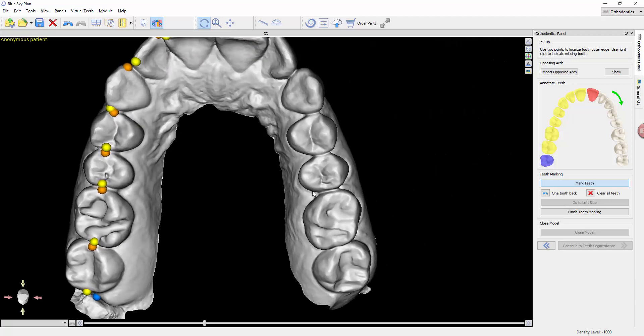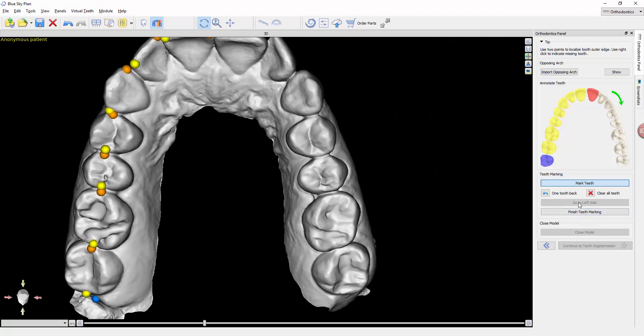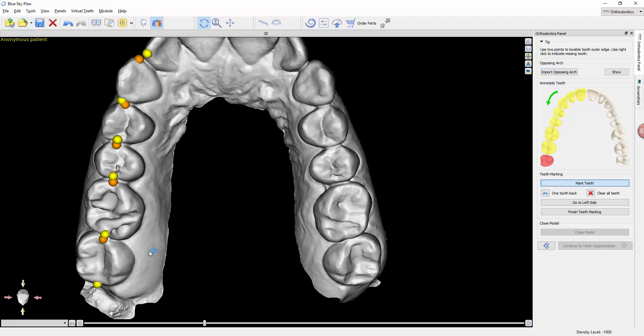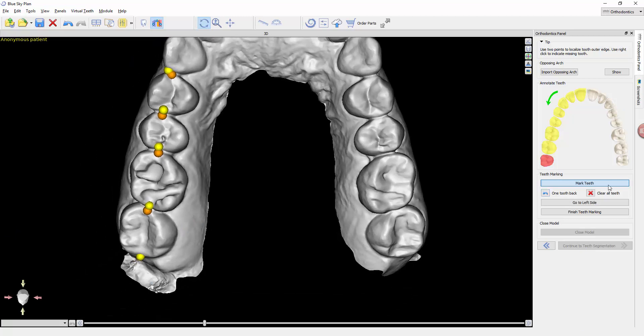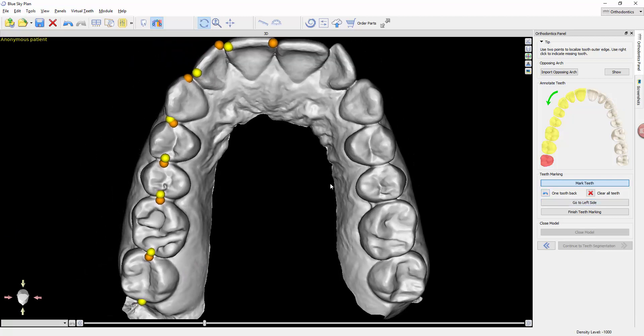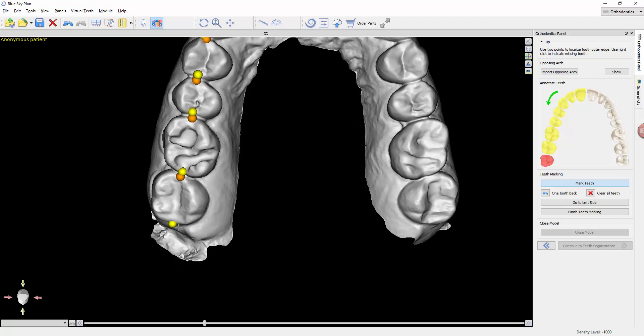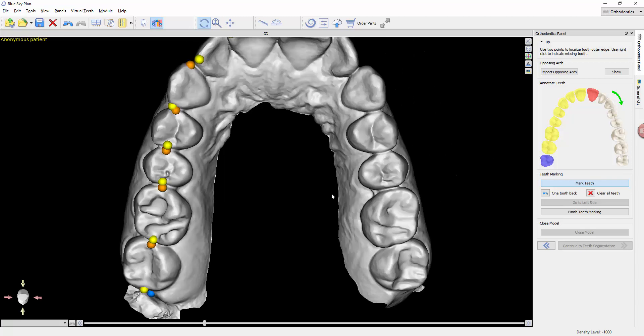For instance, let's go to this side. We don't have a wisdom tooth, we need to tell it to go to the left side. If we've marked the wisdom tooth, there's no more teeth to mark, so it's going to automatically advance us to the next left side.